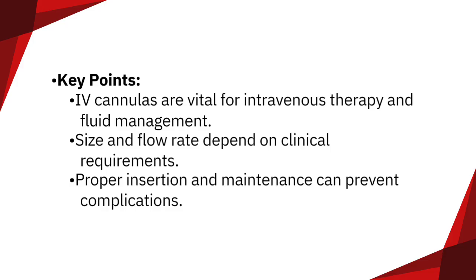Key points. IV cannulas are vital for intravenous therapy and fluid management. Size and flow rate depend on clinical requirements. Proper insertion and maintenance can prevent complications.